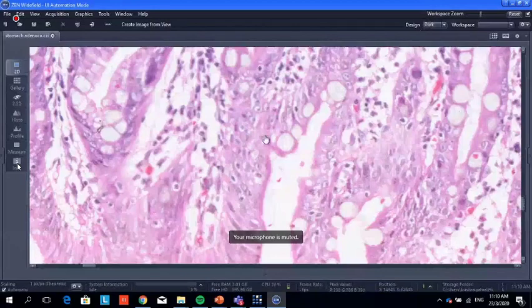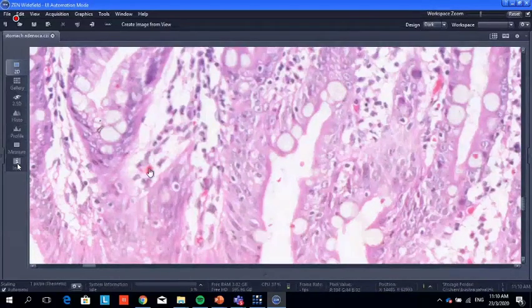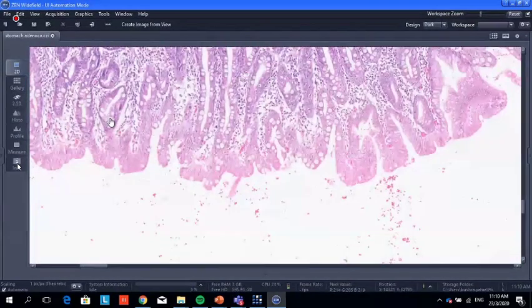Okay, so H. pylori causes inflammation of the stomach. Even H. pylori itself, the bacteria, is carcinogenic. If not treated, it causes transformation of the glands into malignant glands, like this case.